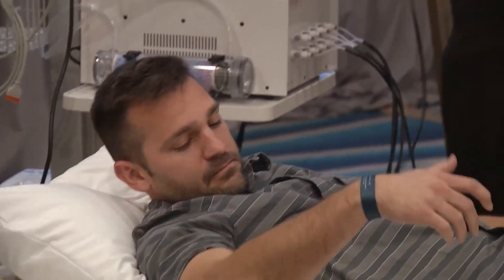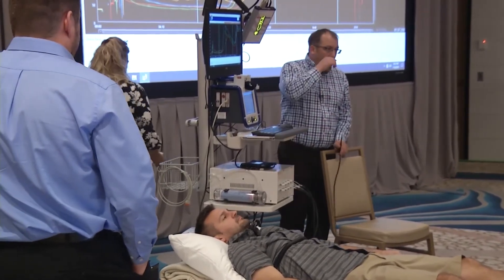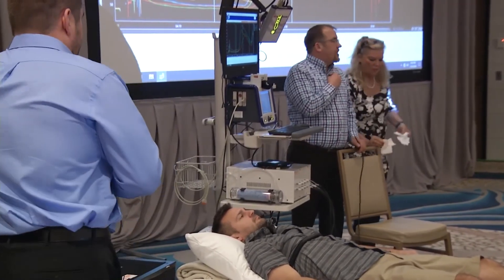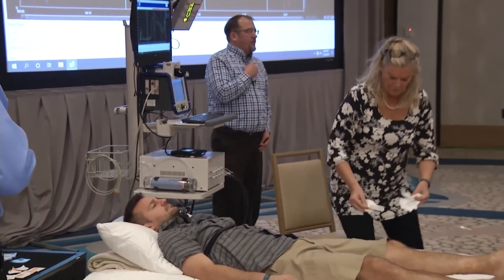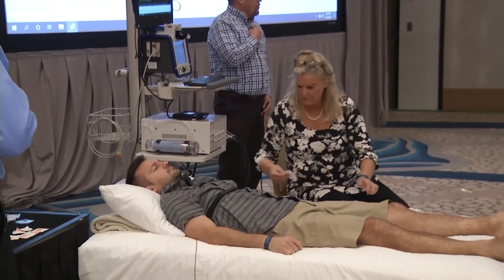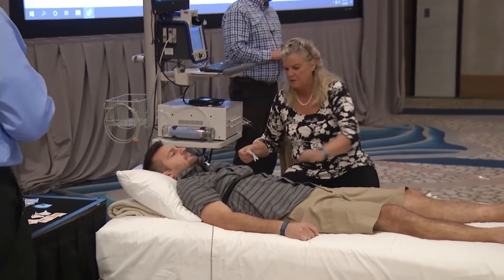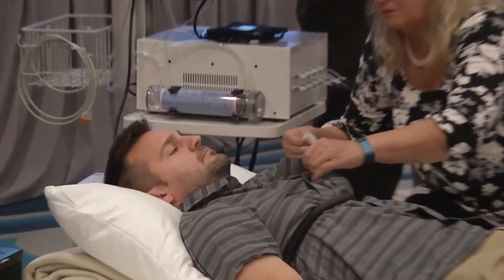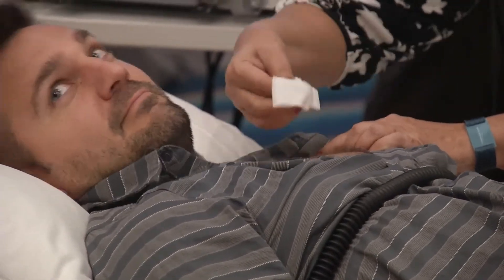Next, we're going to prep for the ECG electrodes using a two-step process. We're going to first abrade the skin with a little bit of Nu Prep. Jade has already shaved for us, so we don't have to do that. We'll go over with Nu Prep, which is going to abrade the skin and help with resistance. Then we have an electrode solution called Cygna Spray that we'll apply over those, and finally put the electrodes on top of that.